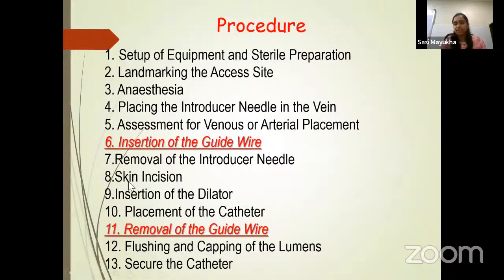Two important things here I've marked in red, because there are a lot of incidences where, during insertion of the guide wire, it is not going freely. Do not push the guide wire, because your access may not be in the right location. So make sure that there is free aspiration of blood before you insert the guide wire. And if there's any resistance while inserting the guide wire, make sure that you pause, reassess, and then insert the guide wire.